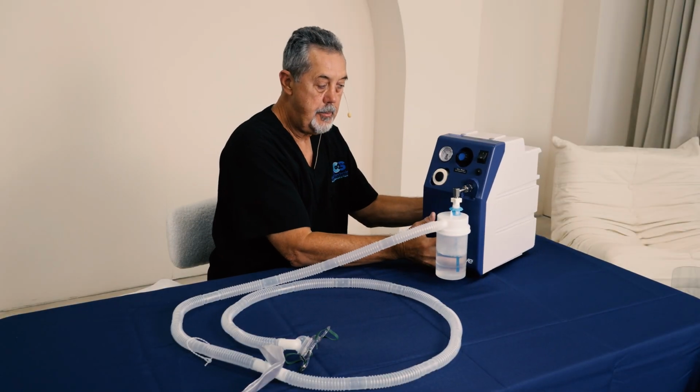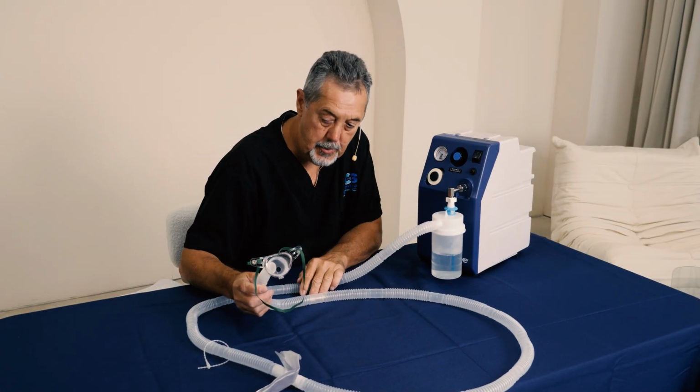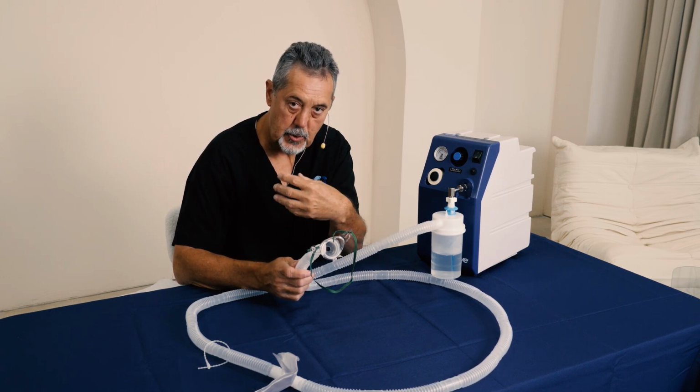Right here, we're at 20 psi. Once you've reached 20 psi, you can push this back in place. When you hook it up to the patient, you want to make sure that you have enough flow to meet or exceed the patient's inspiratory demand.